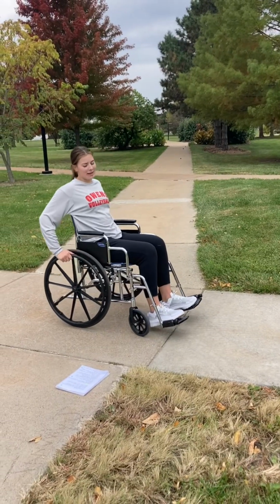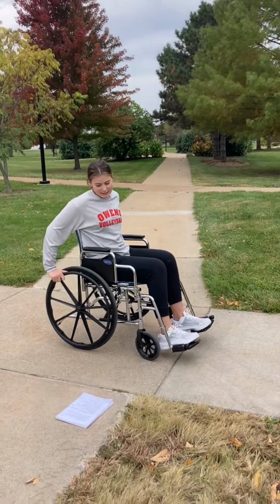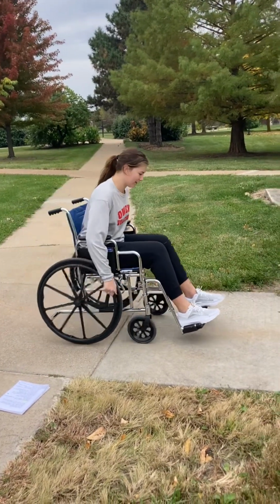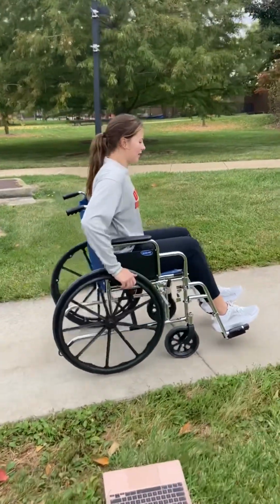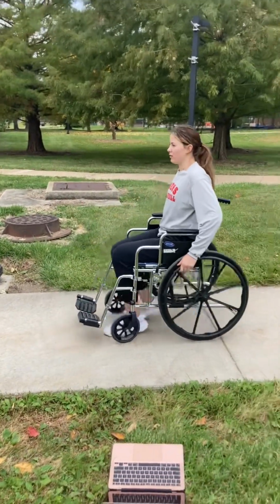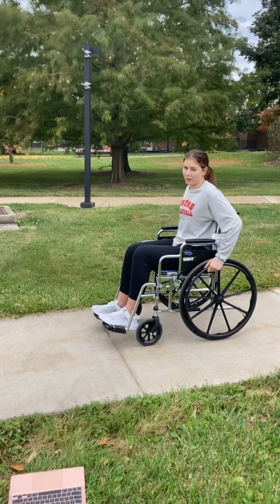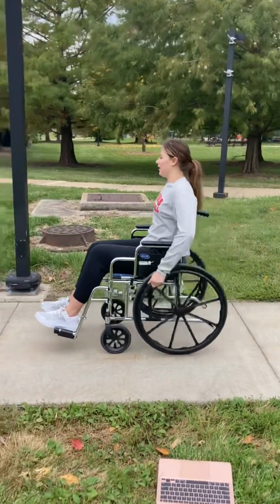So now we're going to do independent for inclines and slopes. So first is ascending forward. You want to lean forward so that your center of gravity will move forward, and you push up the slope. And then to descend, you want to make sure your back is erect so that you don't fall out of the chair when you go down. And then go down the slope.